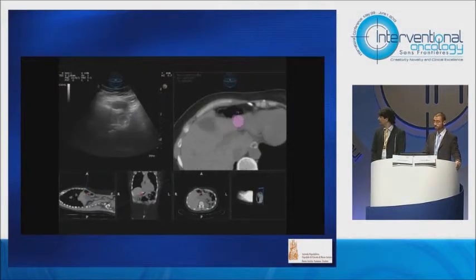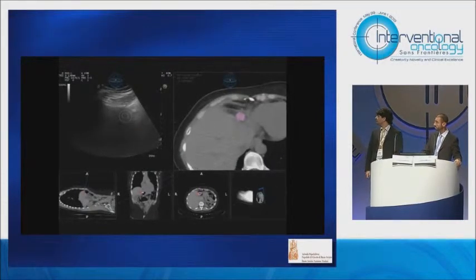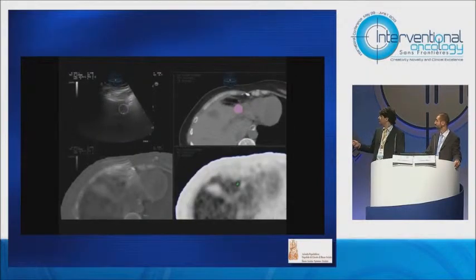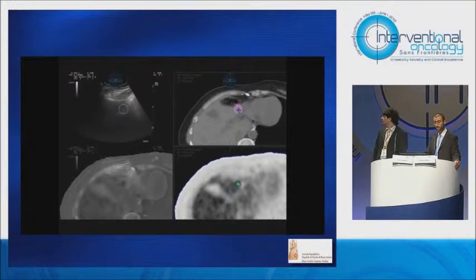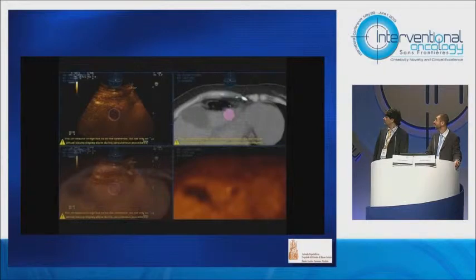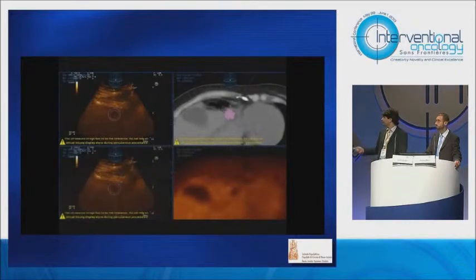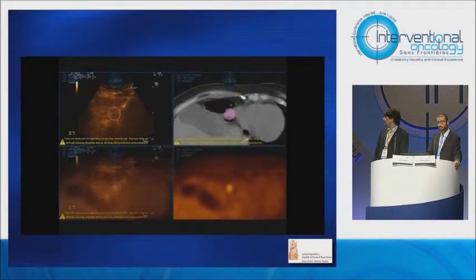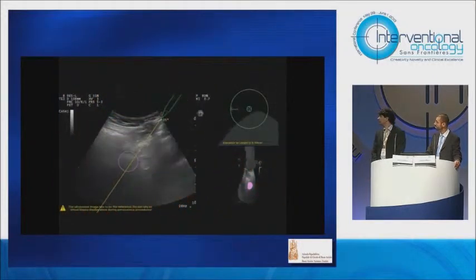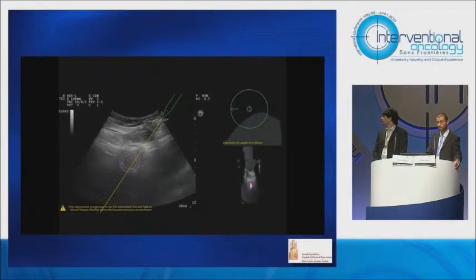This is a case of a patient previously treated in which PET showed local tumor progression close to the previous treatment, so we wanted to ablate only that part. We fused together the PET, CT, MRI, and ultrasound with contrast and identified the target — the portion of the tumor we wanted to treat — and thanks to the virtual navigator, we targeted precisely only that part.